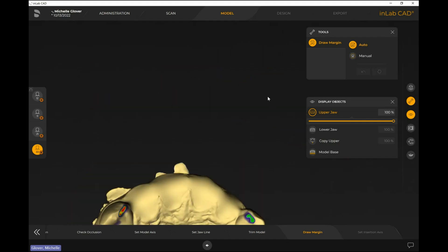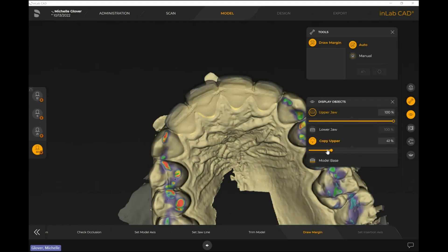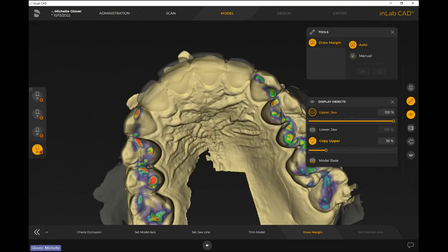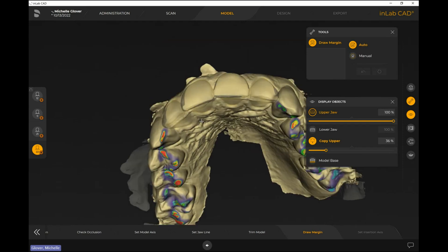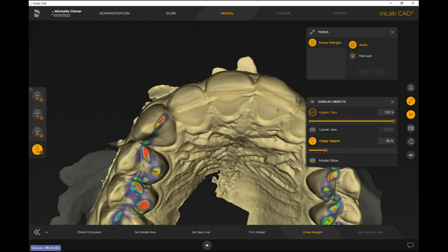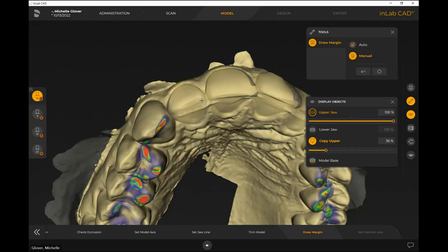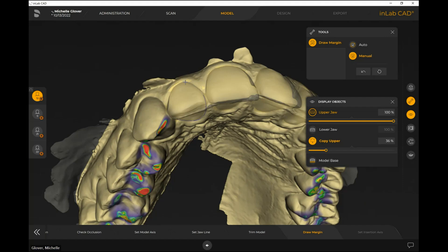Now for draw margin — the reason I duplicated that upper jaw is so I can turn on the 'copy upper' and make it more translucent. Now I know where the margins of the teeth will be. I may not keep the exact anatomy of these teeth, but I do want to keep relatively where the margin lines up — where the tissue and tooth meet. I change margin to manual and go through each tooth. The biggest thing: make sure these margin lines don't intersect with each other, especially in the contact area.